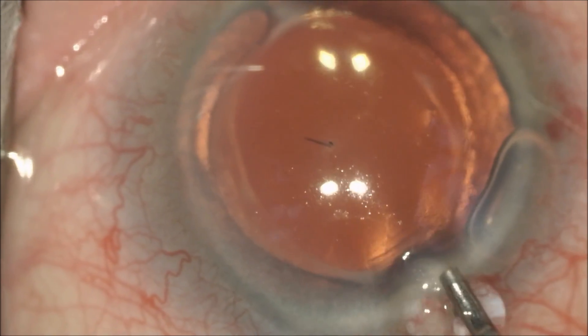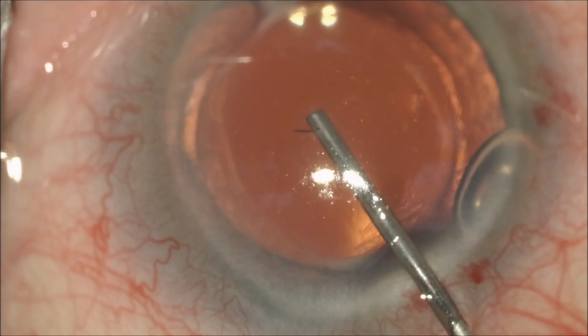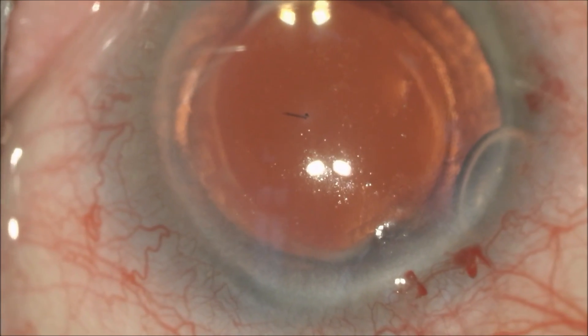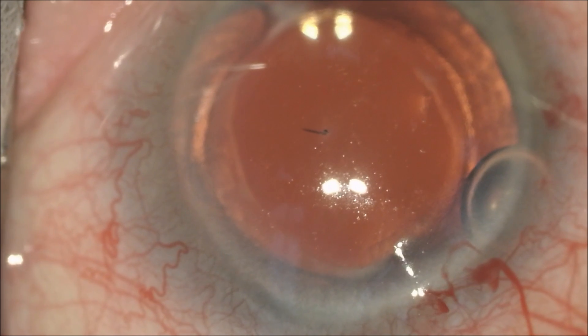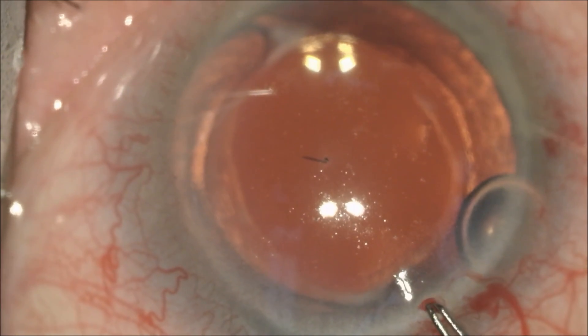Some air bubbles came in with the viscoelastic, which is not a big problem. We just push them to the side with this thick viscous material. You'll see the bee stinger has now been pushed away from the clear cornea using the viscoelastic.